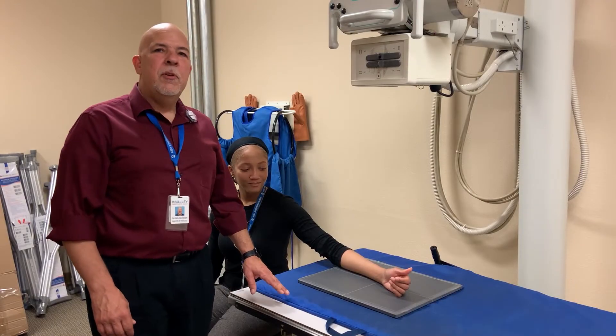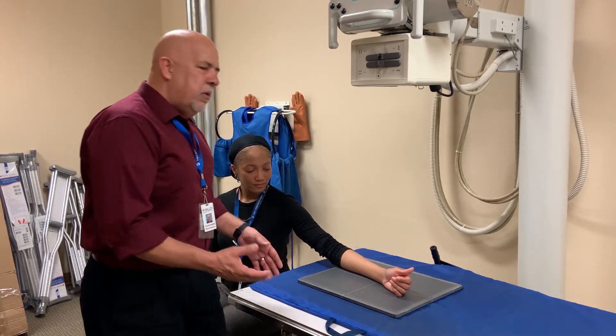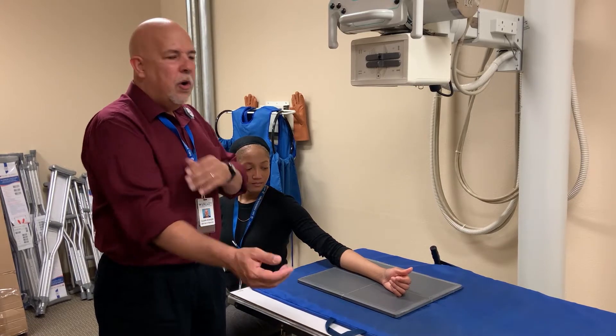Hello, I'm Glenn, and we're going to demonstrate an AP and lateral forearm. The important thing with this is making sure that the wrist, the elbow, and the shoulder are all in the same plane.